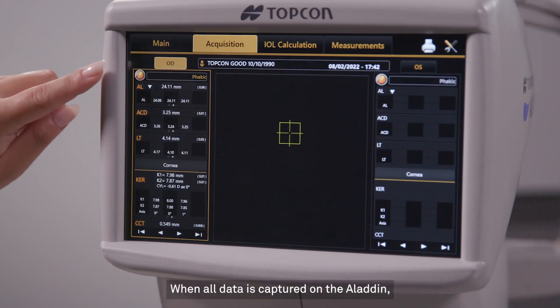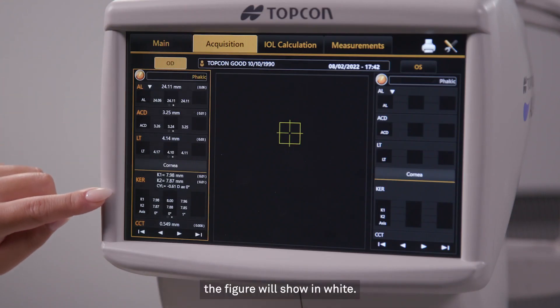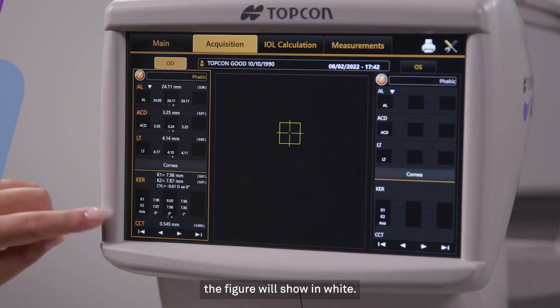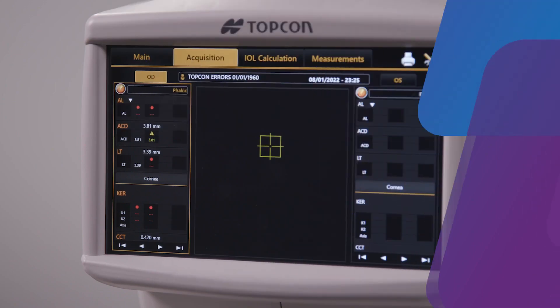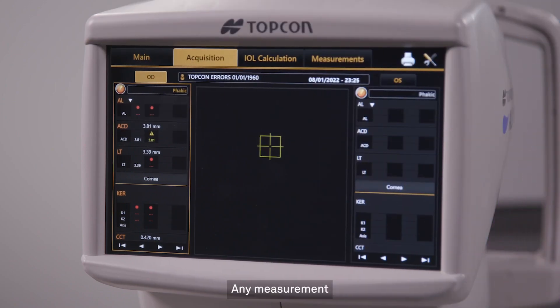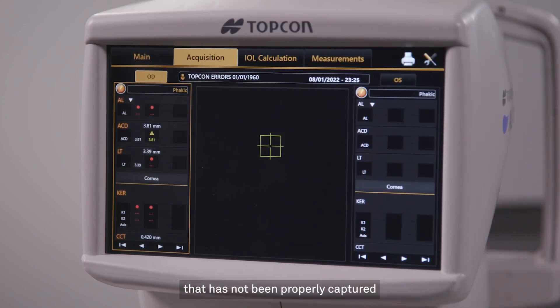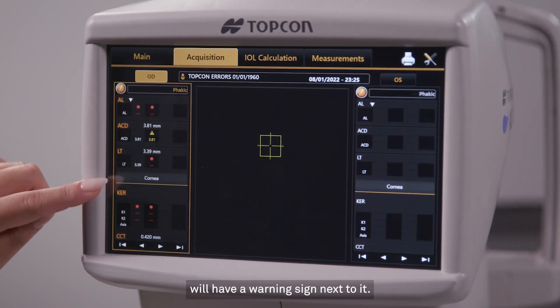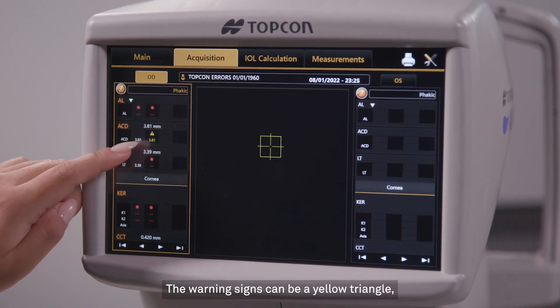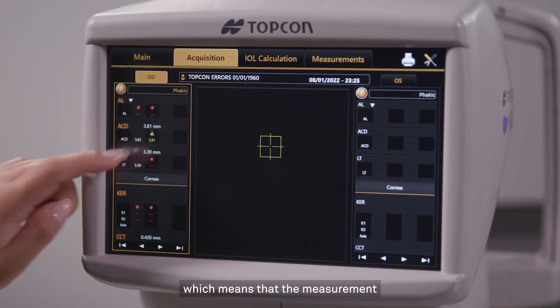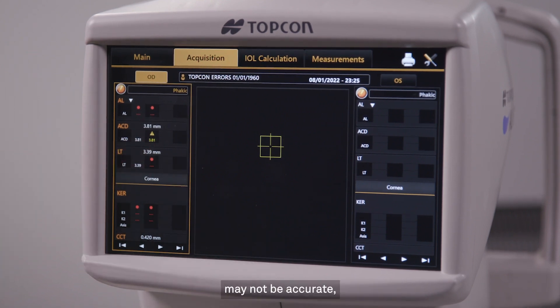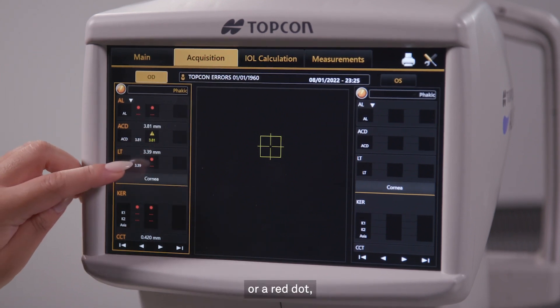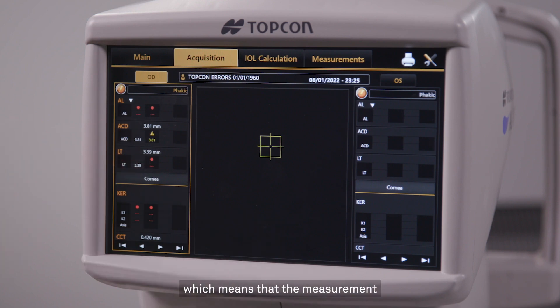When all data is captured on the Aladdin, the figure will show in white. Any measurement that has not been properly captured will have a warning sign next to it. The warning signs can be a yellow triangle, which means that the measurement may not be accurate, or a red dot, which means that the measurement was not obtained.